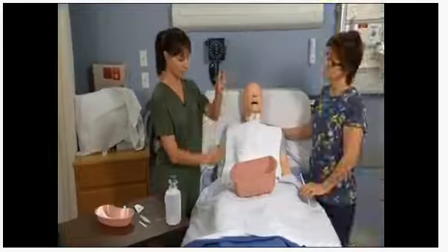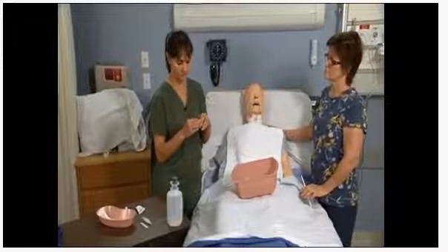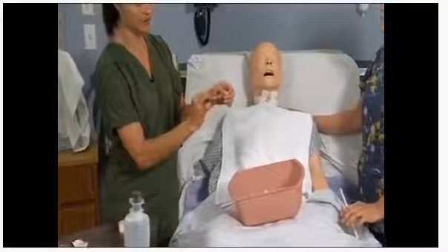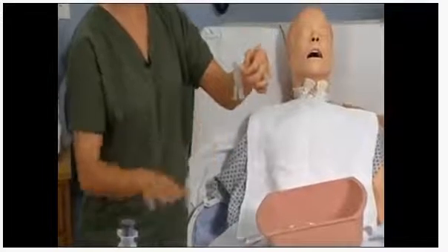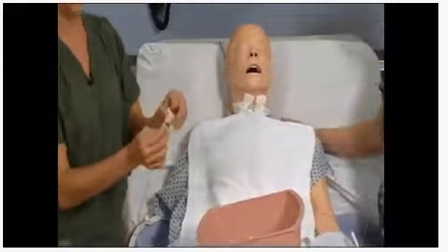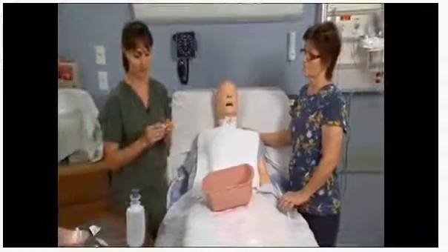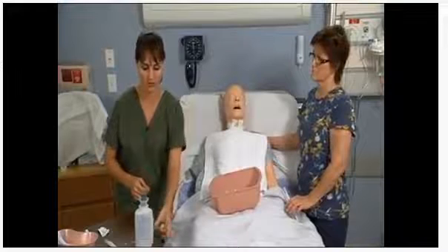After I've marked my tape, I want to go ahead and get my tape ready for once I've dropped the NG tube down. You need to get a piece of tape that's just a couple of inches long, and you need to make a split, but not all the way down, just about 3/4 down. And just put it on a bedside table or somewhere where you can get to it easy. And then get another piece of tape. This is so in case you are by yourself and you don't have an assistant, you have access to everything. And then if you think that you're going to need more tape, you can just roll out the tape and then just also put it on the bedside table.